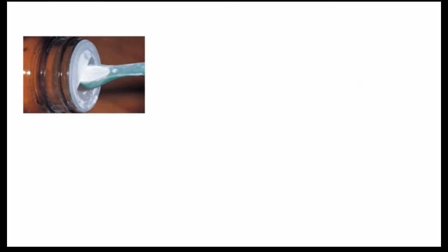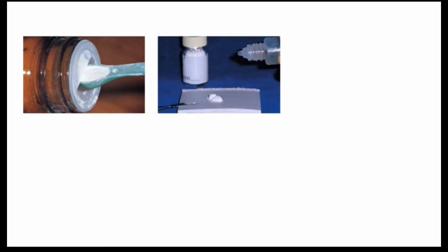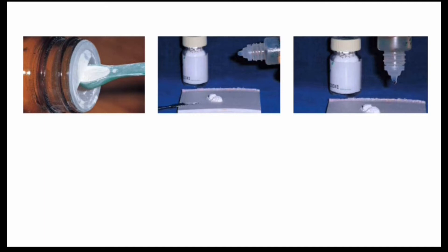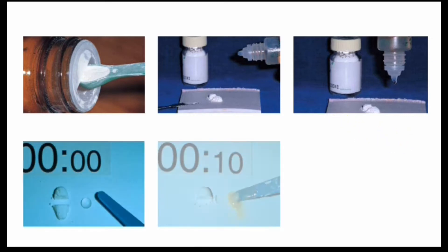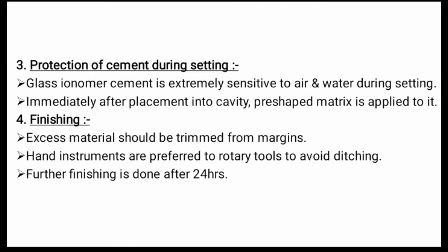In the mixing demonstration: first, take an adequate amount of GIC powder and the liquid GIC in the required ratio, then divide the powder into two equal parts. The liquid is dispensed onto the mixing pad, then mixed using sweeping and folding motion.